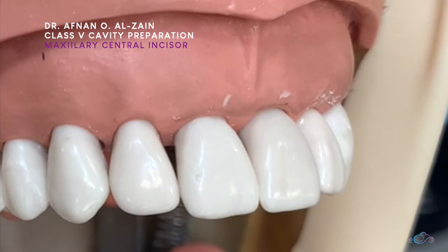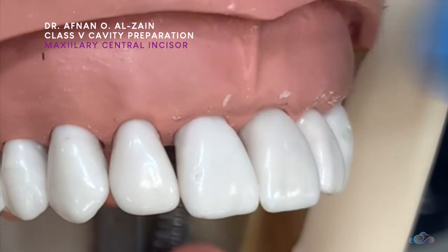Hello everyone, I hope you will be good. In this video, I will show you how to do class 5 in an upper central incisor.